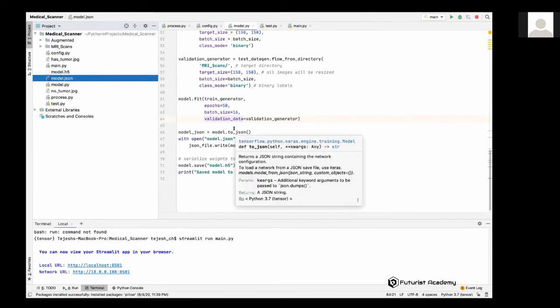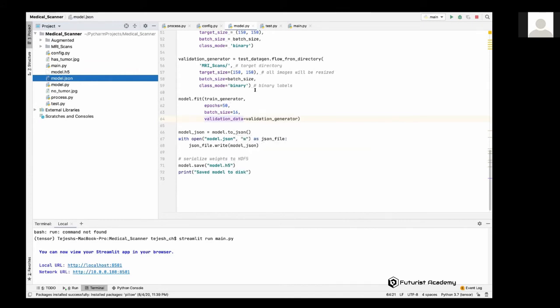And so to achieve this, I applied a traditional multi-layer perceptron that uses a softmax activation function in the output layer to connect all the neurons in the network. And the output from these neurons and layers represent high-level features of the input image. And it uses these features for classifying the input image into various classes based on the training data set.